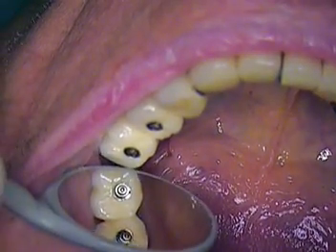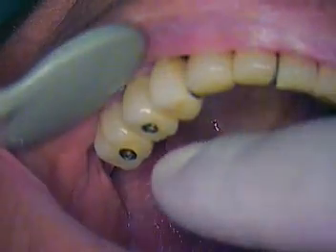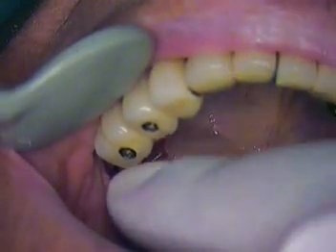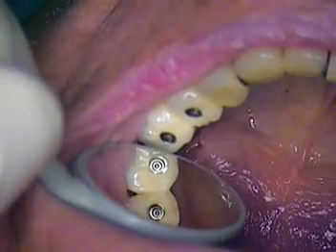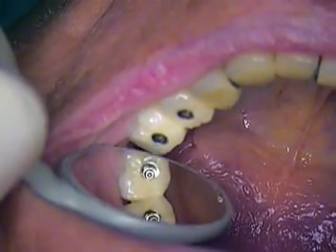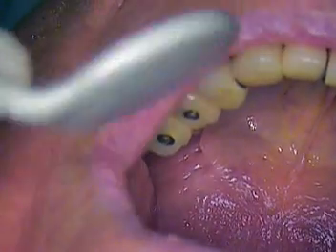Now we're going to walk away a little bit. What's next is just a little bit of wax and then some composite to go down in there — I don't need to show that at this point. Sometimes the metal, although it's heating up in the mouth, may be a little more elastic and then we can torque that down. So we'll see in five minutes.